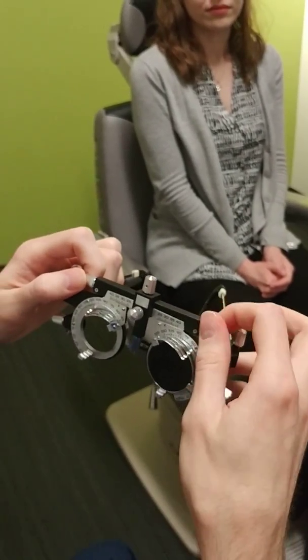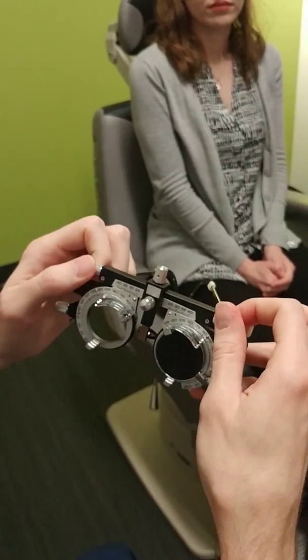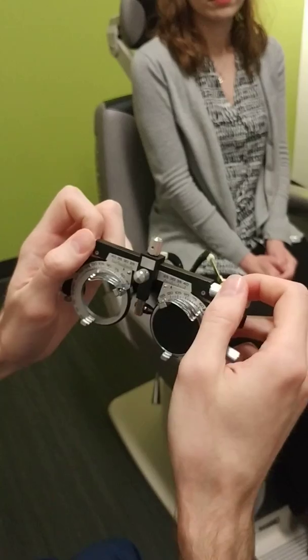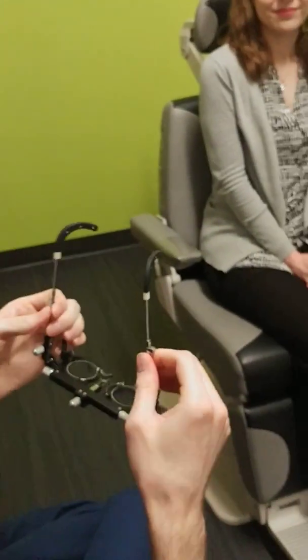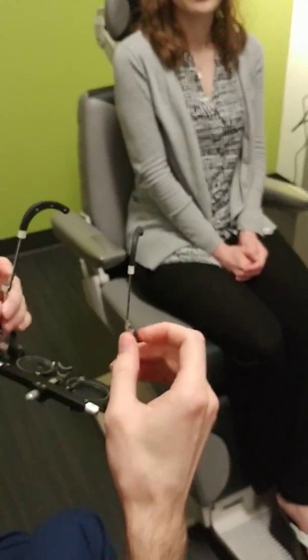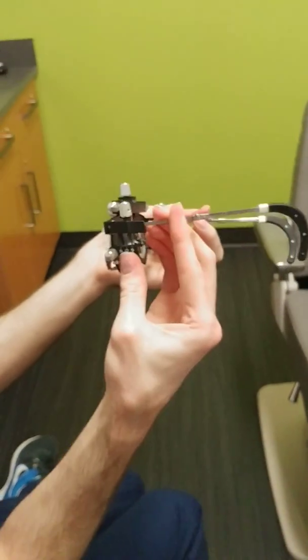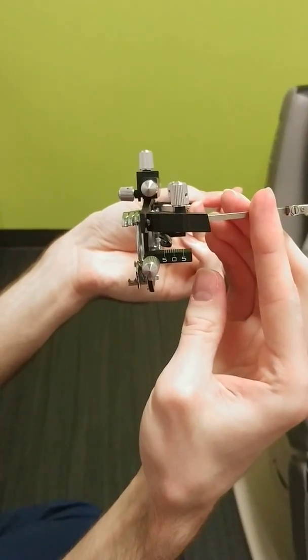The last adjustment is the PDs. Trial frames let you adjust the PDs separately. You can spin it and see what the numbers are. You can actually use these to measure PDs as well. And there's also a little vertex scale here to see how far away your trial frame is from the patient's face.